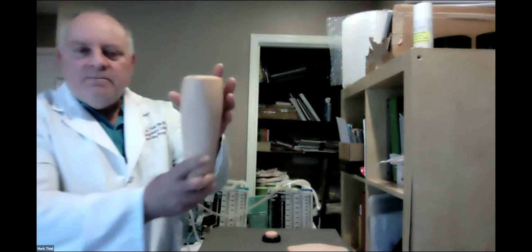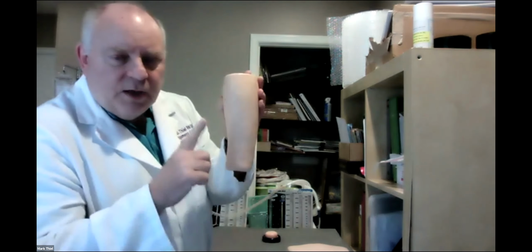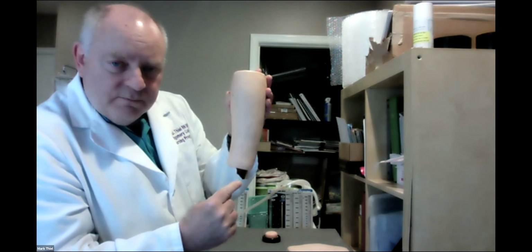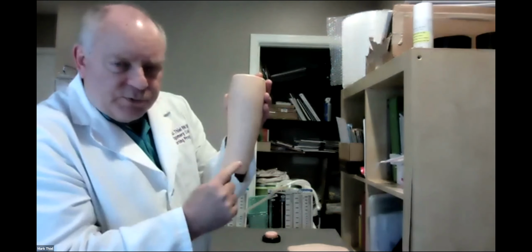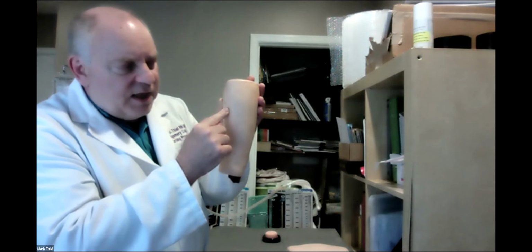Secondly, where is it? On the thigh, right? The muscular anatomical location is the muscle of the vastus lateralis, the largest muscle in the thigh. Today, here's my miniature mannequin of a leg. What we do anatomically is we line up straight down the middle in the line of the femur. Now, we don't inject right on the middle. What we do is go to the very meaty part of the vastus lateralis.